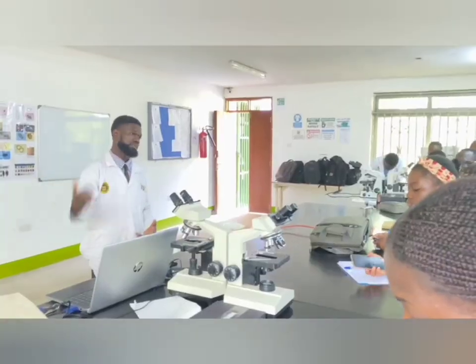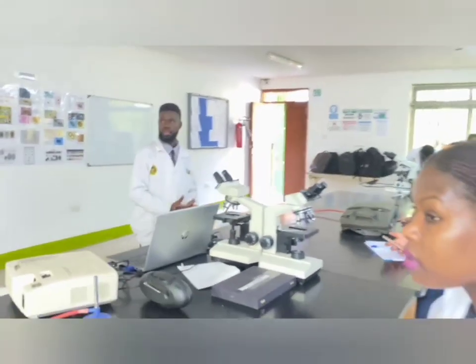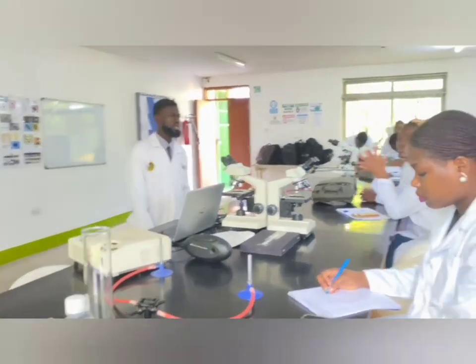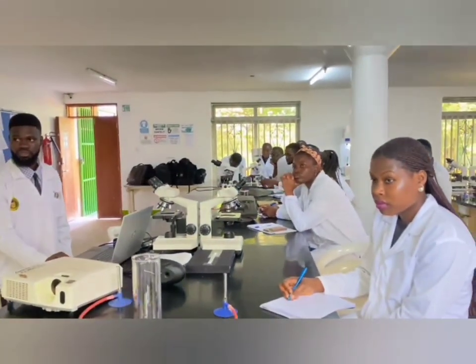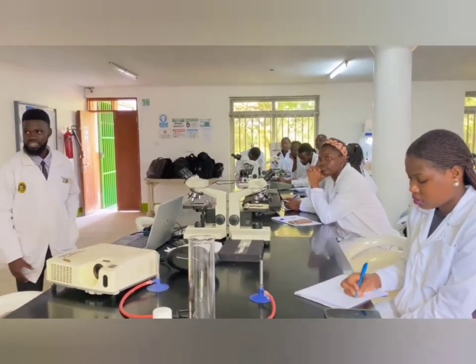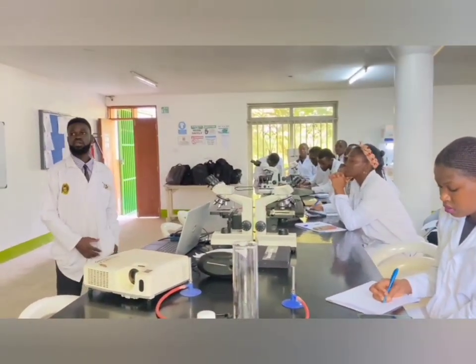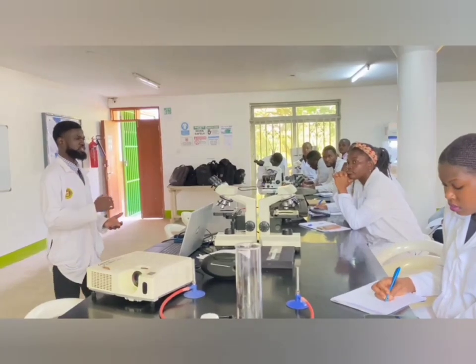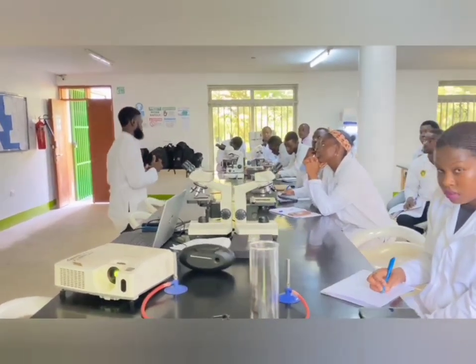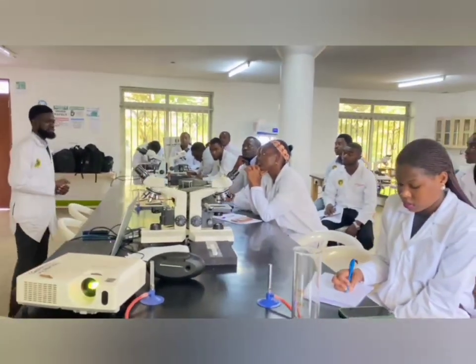There are a variety of methods, but the one we're going to learn today is the disk diffusion method, which is also described as the Kirby-Bauer disk diffusion method. We should know its clinical application and relate it to antimicrobial resistance detection, because remember our topic is to help us detect antimicrobial resistance.